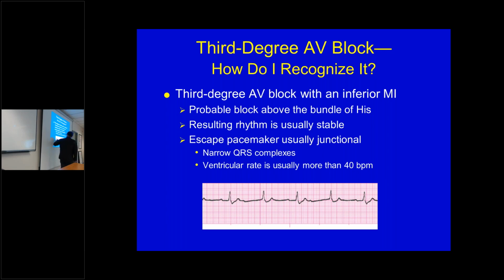Because the P wave is continual. Let's see if we can identify at least two P waves. That one's probably buried, so you've got those two P waves, and you can identify them as P waves, right? So then you want to march it out. That P wave is buried right there. That P wave is right after the T wave there. On different sides.